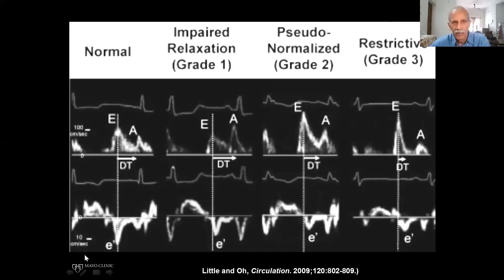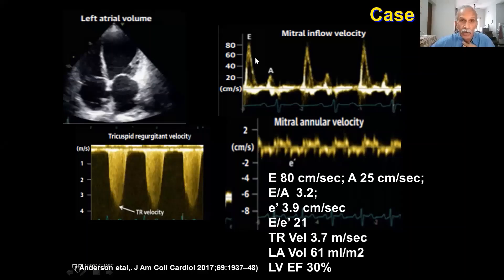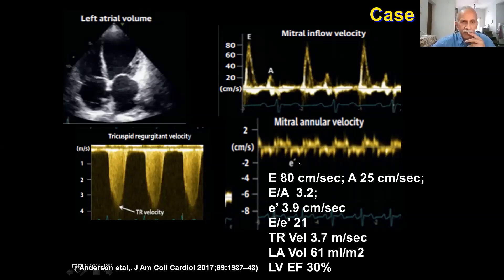This is another one — a patient from Dr. Nage's lab with LV dysfunction: LA volume is increased at 61 ml and EF is 30%. The E-wave is normal, but A is quite diminutive and the E/A ratio is greater than 3.2. Deceleration is sharp. This puts it under restrictive filling. Clearly LV dysfunction with E/A ratio greater than 2 indicates elevated filling pressure. But if you want to get it better, look at the annular velocity — extremely low at 3.9 cm/s. EE' ratio is 21. Needless to say, this patient also has elevated RV systolic pressure secondary to chronic elevated LV diastolic pressure. This tells you how each one complements the other.